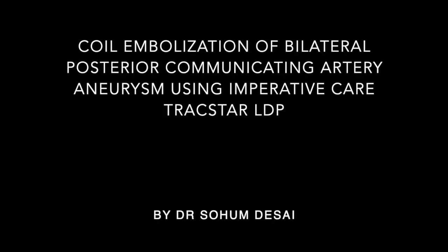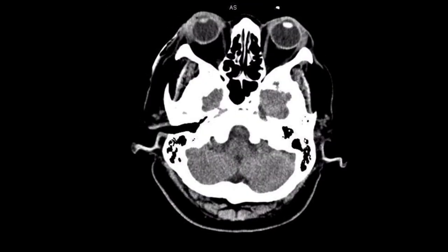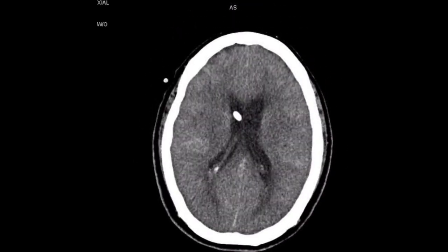Good morning. This video is going to demonstrate the use of the Tracstar LDP guide from Imperative Care in coil embolization of ruptured bilateral PCOM aneurysms.